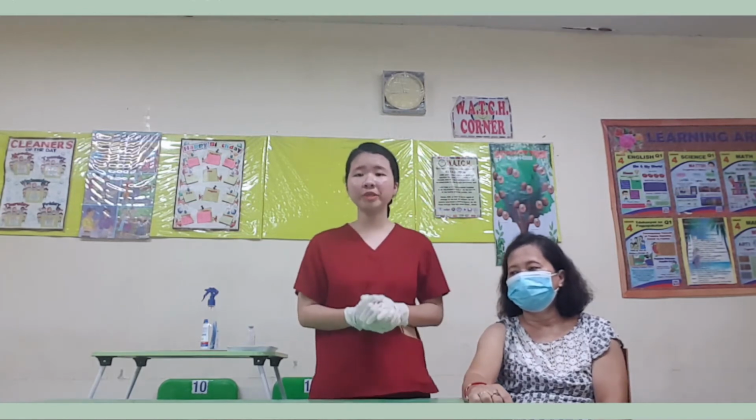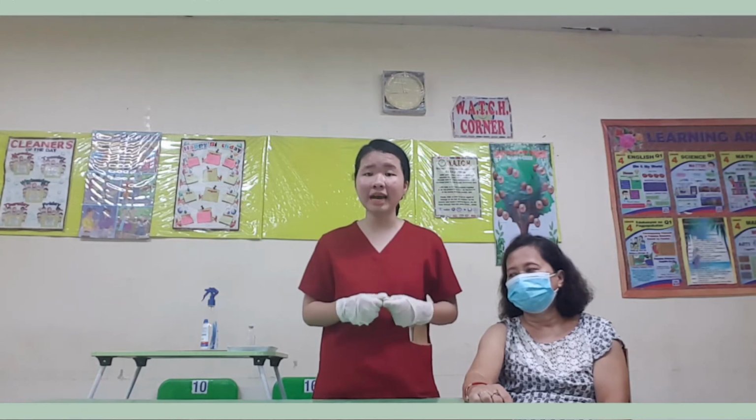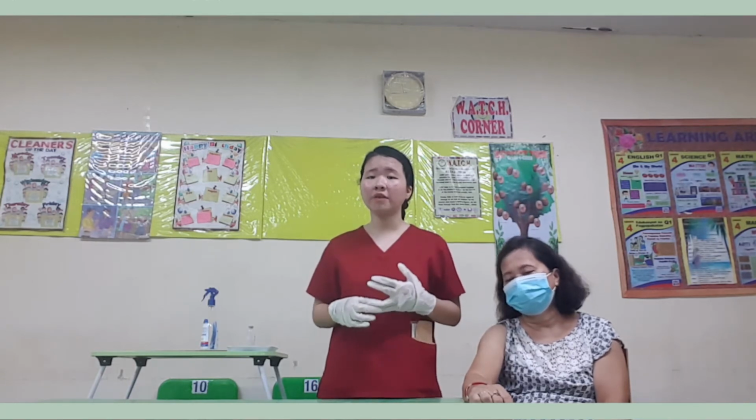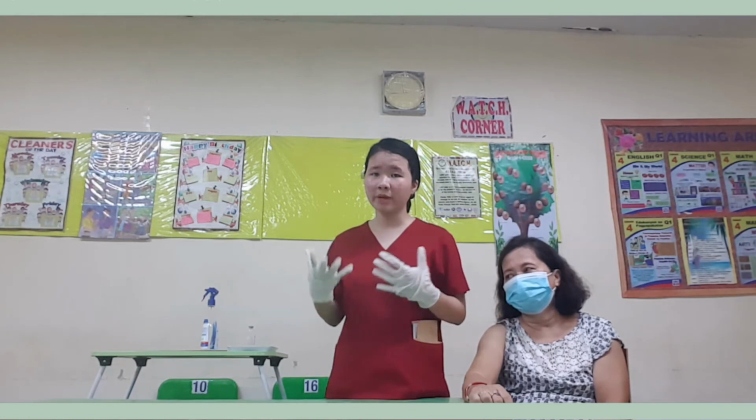And now we're going to proceed to procedure number 16, which is to pinch the site with the non-dominant hand. Insert the cotton between the 3rd and 4th finger. By doing so, the patient will feel the pain of the pinch rather than the needle insertion, which is more painful.